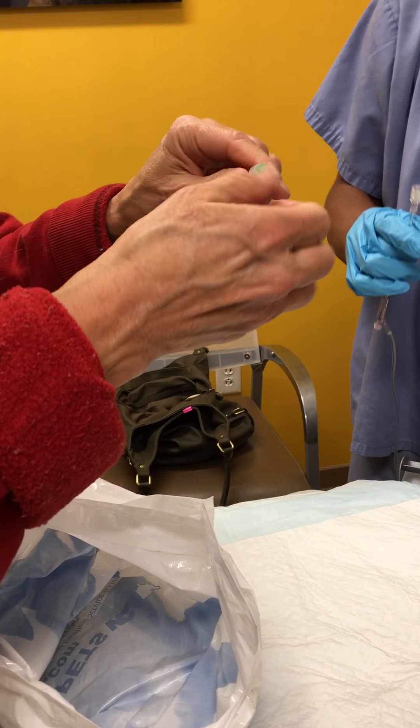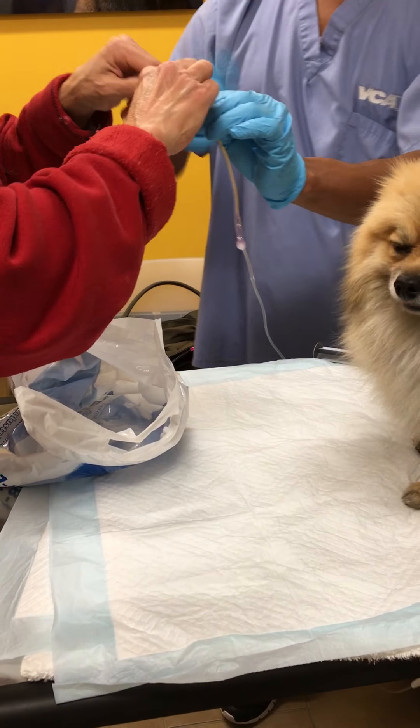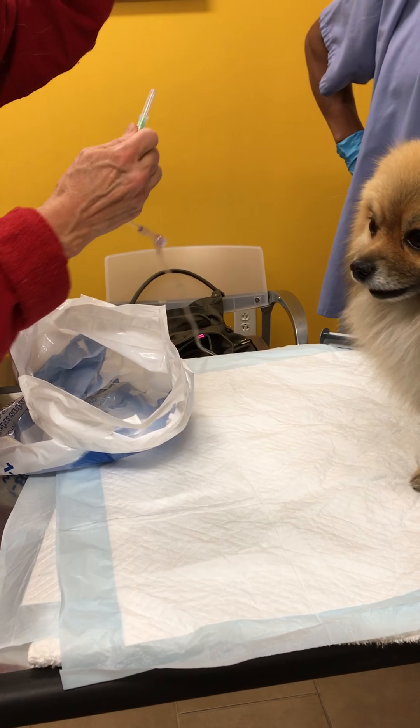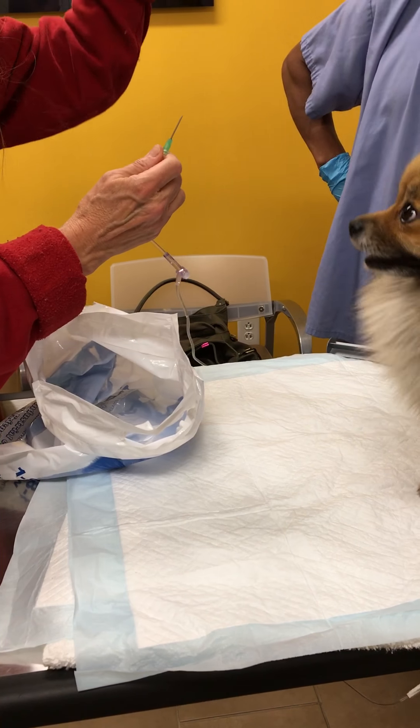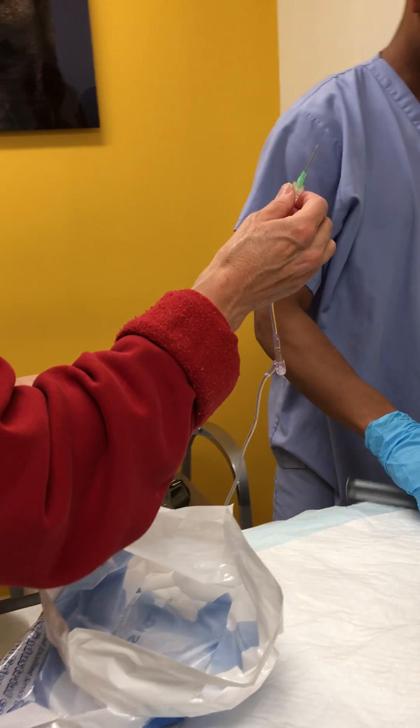Now you said this is— oh, oh, oh. Be careful. Don't take it away. Don't do that. Put it in here. Righty-tighty. And then this thing's going to come off. You've got to do it. There it is. There we go. That's perfect. Just pour it off. I scared the living kabolis out of me. Sorry. All right.